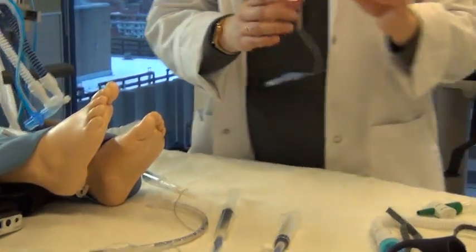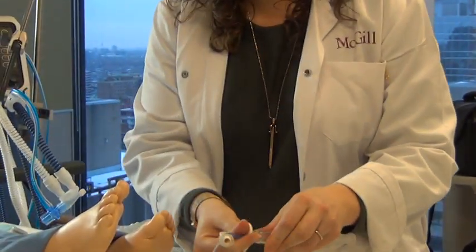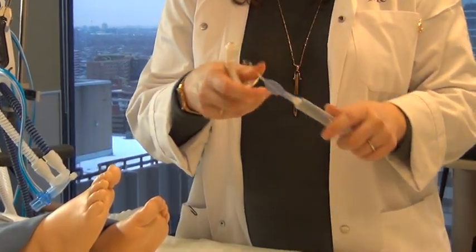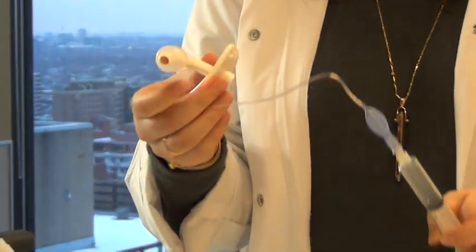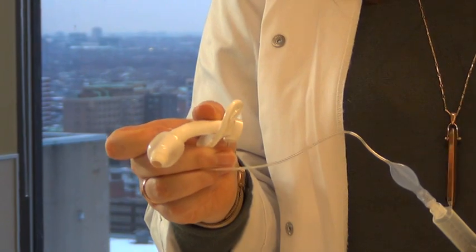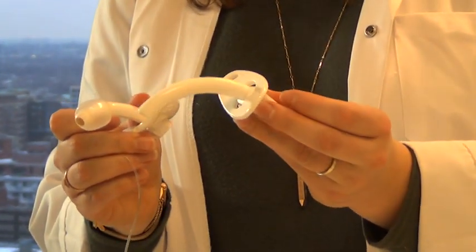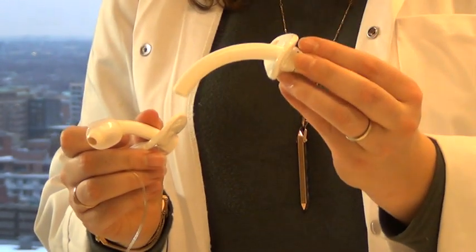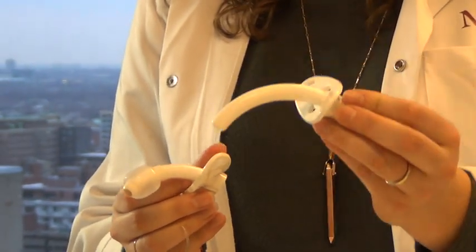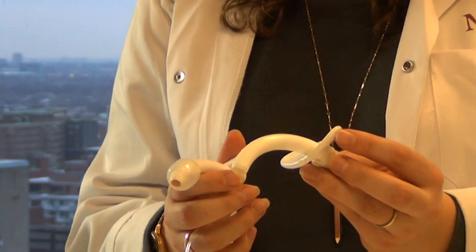Now it's the same idea with a tracheostomy tube. A tracheostomy tube also has a balloon when patients are ventilated. So this balloon here that we would inflate serves the same purpose as it would on an endotracheal tube. The other option is a cuffless tracheostomy tube, and these are for patients on any medical surgical floors or in rehab. They would have a cuffless tracheostomy tube, as they don't require mechanical ventilation.